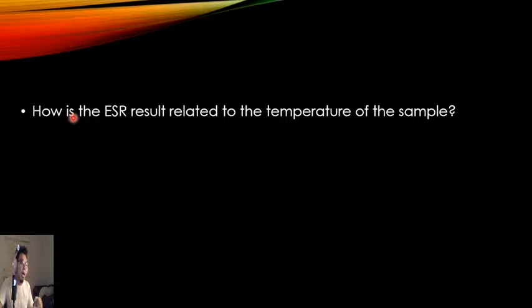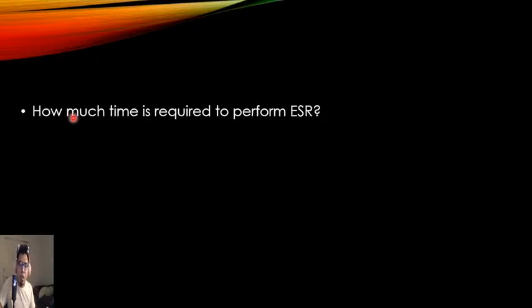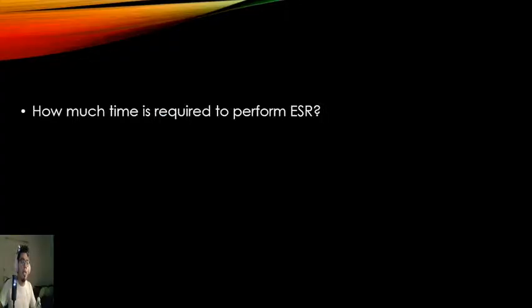Okay. Next, how is the ESR result related to the temperature of the sample? Well, basically, temperature is directly proportional to the rate of sedimentation. Okay, it's directly proportional. The standard temperature is usually room temperature, obviously. And how much time is required to perform ESR? It's an hour or 60 minutes if you want to be more specific, or you just convert it to seconds if you want to be extra specific.